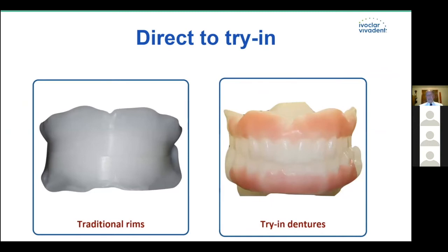And the idea behind it, as I mentioned, is we ignore the rim stage. So that instead of looking at those shiny rims, we could look at teeth.